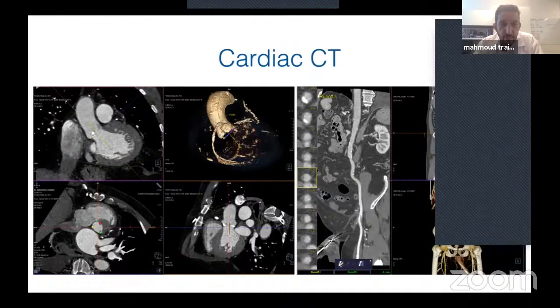Now, as we're all aware and was mentioned in a previous talk, when we assess these patients with aortic stenosis for therapies, cardiac CT has really become the cardinal feature after echo in terms of assessing. So we can assess the annular dimension on the CT, we can assess coronary height, the calcification. We actually can get a better assessment of whether it's bicuspid or tricuspid. It's often missed on echo, where you can't really tell with the calcification. You get a true exact delineation of that. And we get a very good delineation of the iliofemoral anatomy, which is essential for evaluation of patients for potential TAVR.